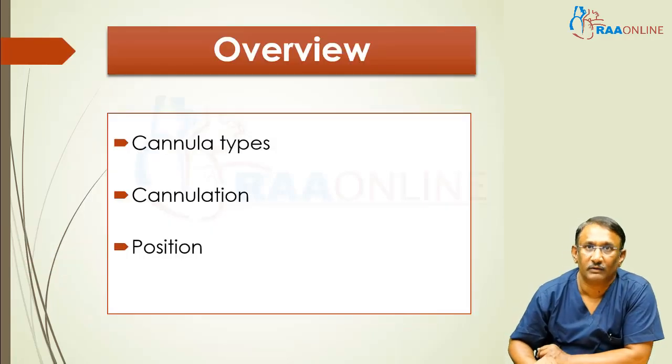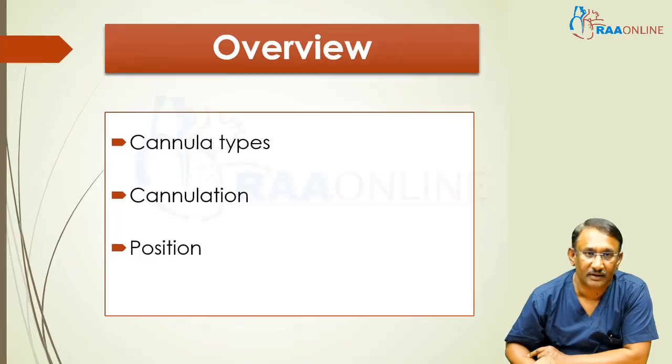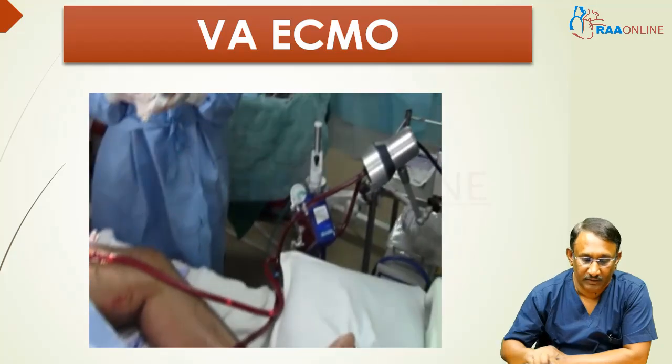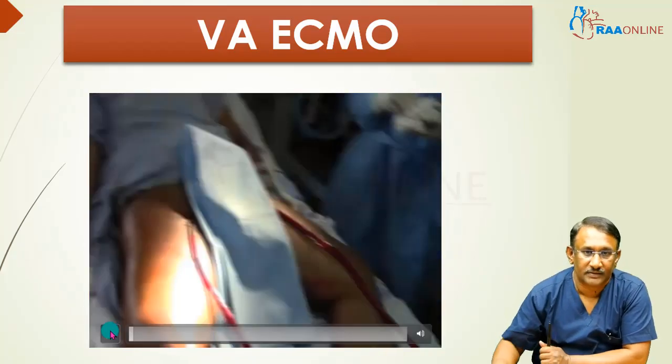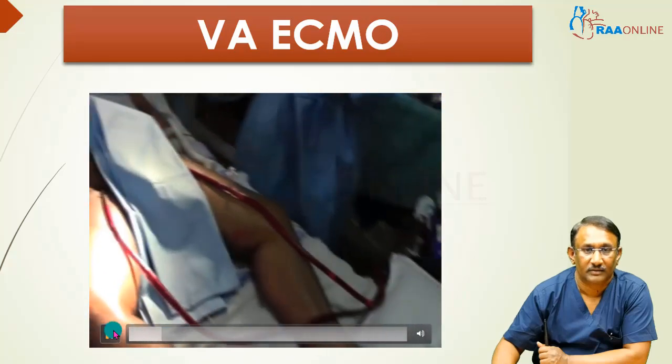So this is the overview of the talk. One, we'll look at what are the different types of cannula, then what is the cannulation technique, and finally, how do we position this cannula in that particular patient. So this is a VA ECMO. As you see here, this particular patient has two cannulae, one an arterial cannula, the other a venous cannula, and you have connected that to the ECMO circuit.